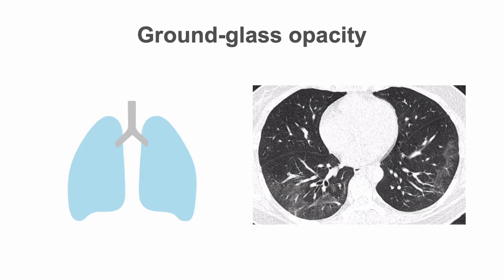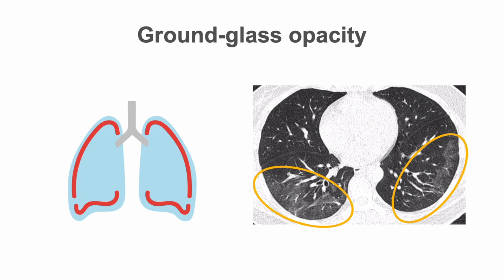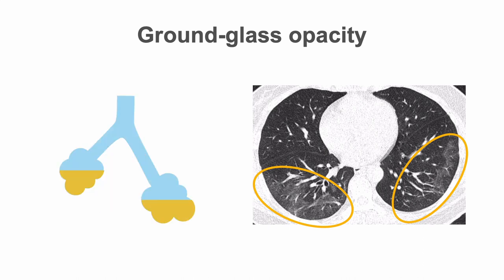The predominant CT abnormalities in COVID-19 are bilateral, peripheral, and basal predominant ground glass opacities. Ground glass opacity is a non-specific CT finding associated with a hazy opacity that does not obscure the underlying pulmonary vessels or bronchial structures. Its presence suggests a partial filling of the air spaces in the lungs by inflammatory exudates.